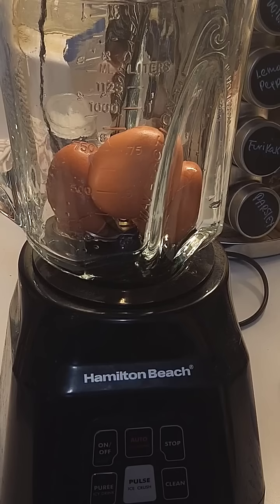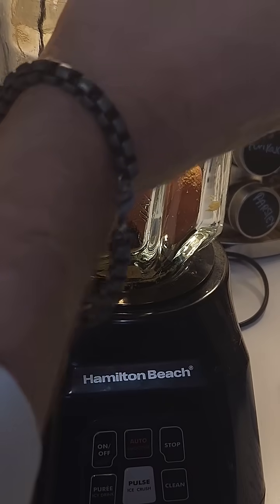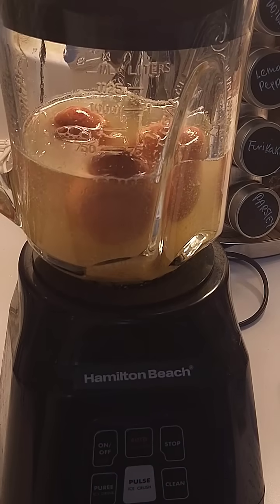For the nutrient broth today, we'll be using three full eggs, a tablespoon of nutritional yeast, a tablespoon of dextrose, and 500 milliliters of distilled water. Start with the eggs, add a tablespoon of nutritional yeast, and just a little over a tablespoon of corn syrup. And now we can blend.